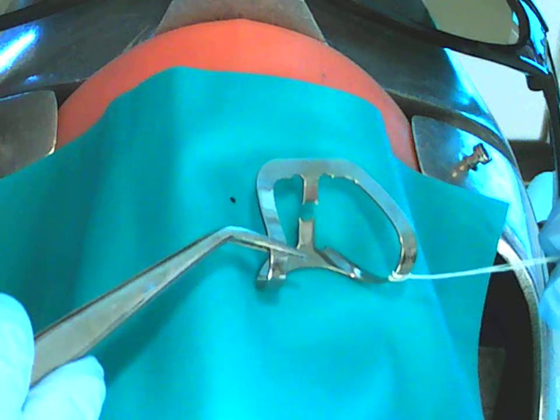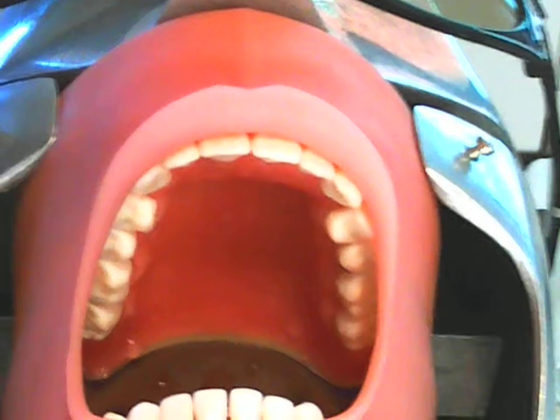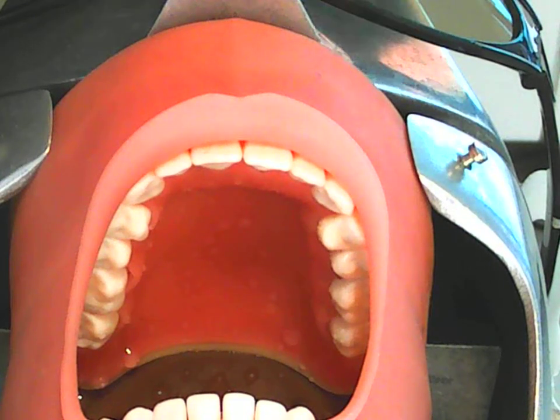Okay, I have already chosen this clamp. I knew ahead of time that's the one I'm going to use because it's for a tooth that needs an endodontic treatment. Okay, and I have attached safety floss onto the clamp. Okay, I am prepared now, so I want to check the anesthesia for effectiveness.